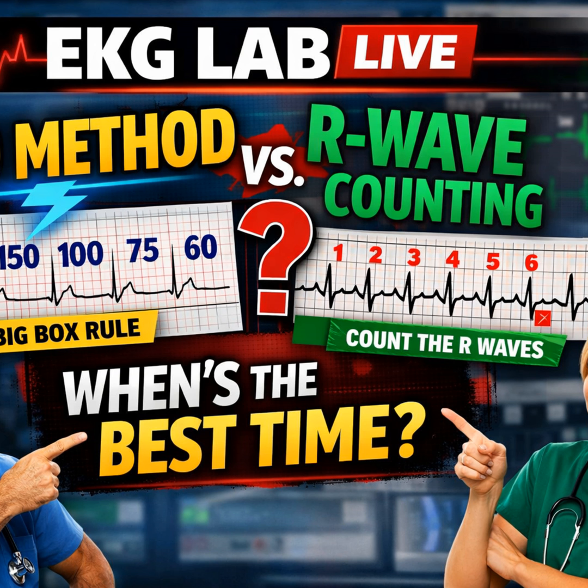Counting 1, 2, 3, 4 spikes. Okay, rate's roughly 40. Start CPR. That's robust. It uses a lower level of cognitive processing, which is exactly what you need in a crisis.